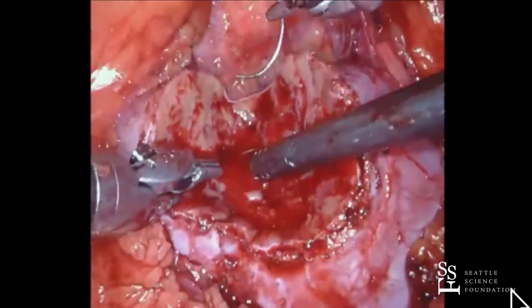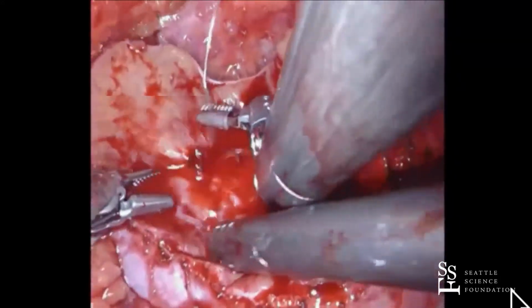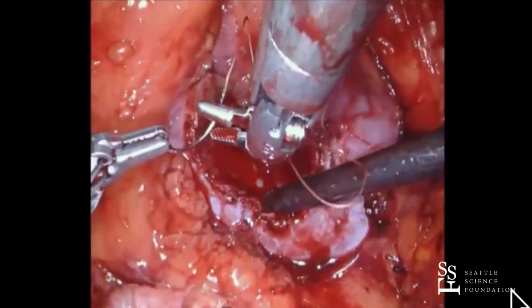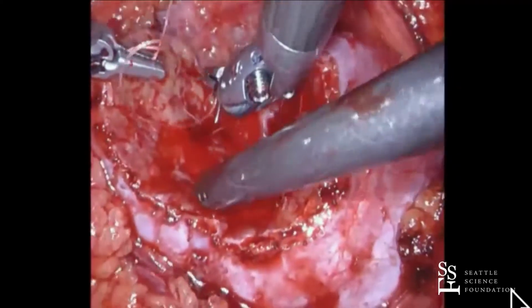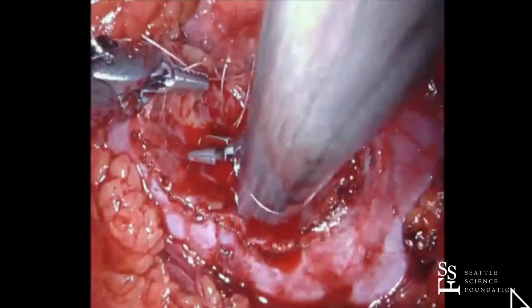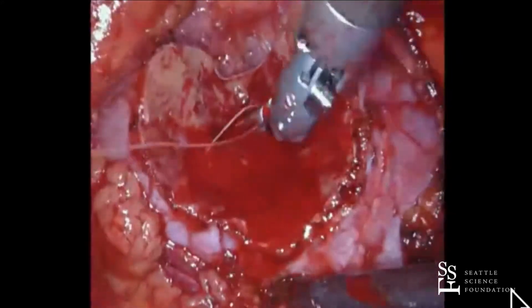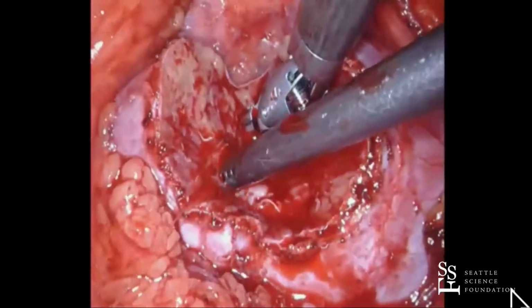Okay, let's see what we got. Now, we could probably get a lot of this. There's nothing really, but it's kind of an ooze here. And the ooze you could probably get with the Renorrhaphy stitch. The reason I like to close the capsule is that I always worry that if I don't get every vessel, then I've got the capsule that could be open and causing a problem.